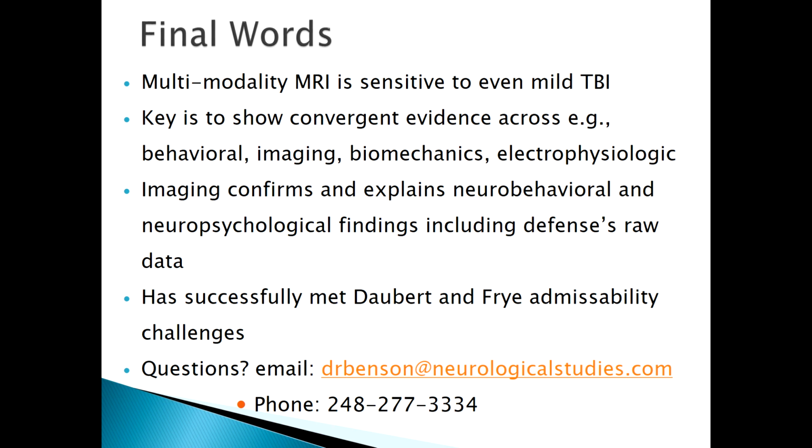There are some image processing techniques that we use to minimize that as much as possible. One of the main ones is statistical analysis where we compare. Typically, we use 87 healthy controls, and we age correct so that age is not an issue, and we do a statistical comparison of only the white matter between our index patient and our normal controls.